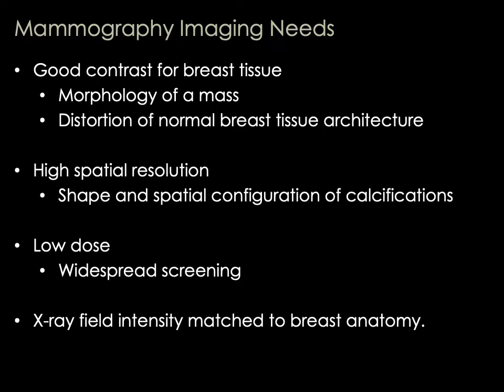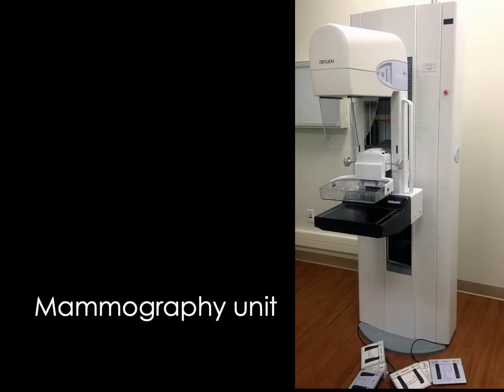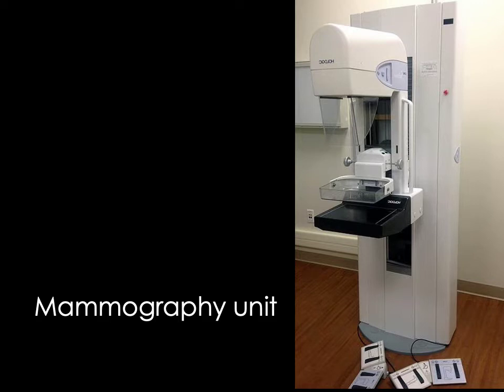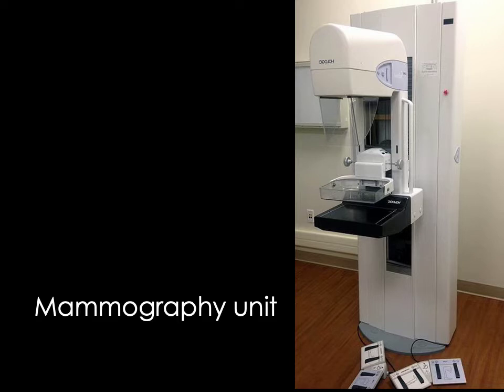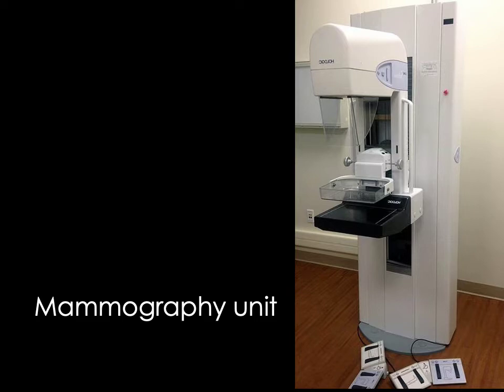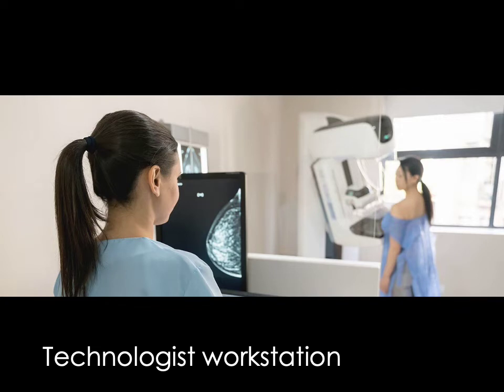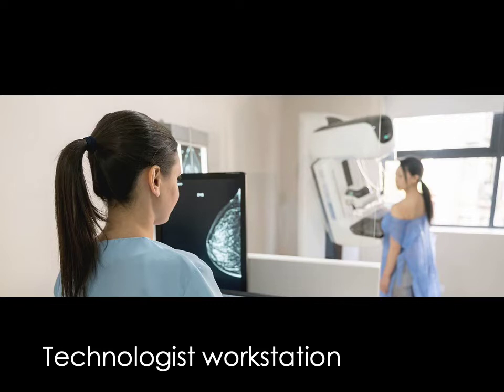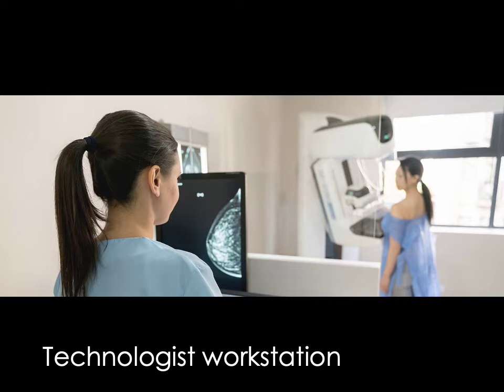For these reasons, mammography uses specialized equipment. Systems from different vendors may look slightly different, but they all have the same basic components. This is a digital mammography system with combined conventional 2D and tomosynthesis capabilities. One component, although not shown in the picture, is the technologist workstation. This is where the technologist sets the imaging parameters for each patient and reviews the images to ensure adequate coverage and image quality.